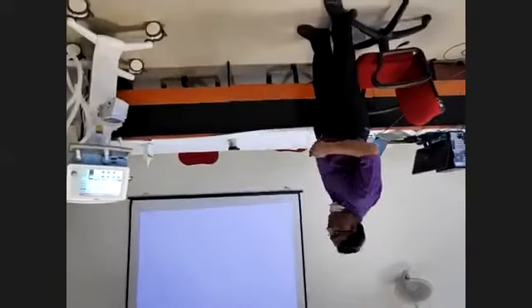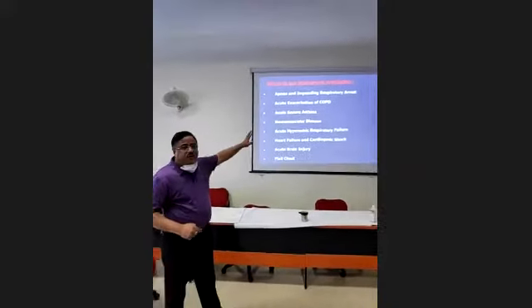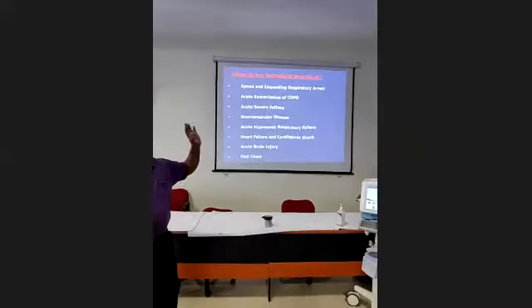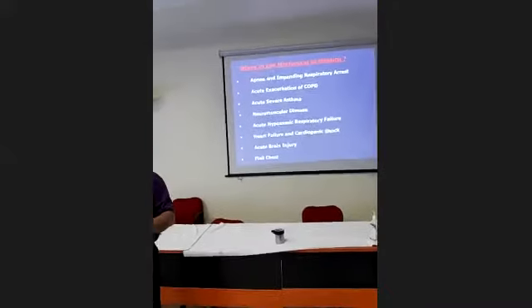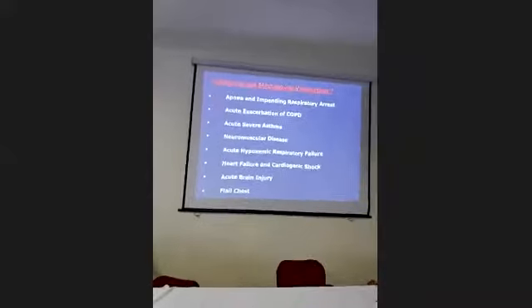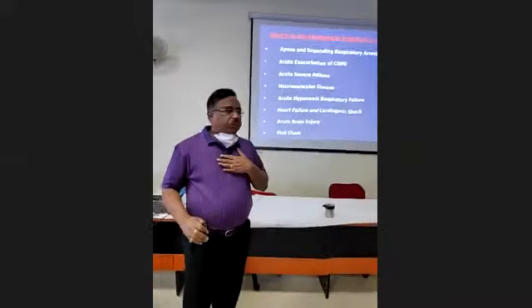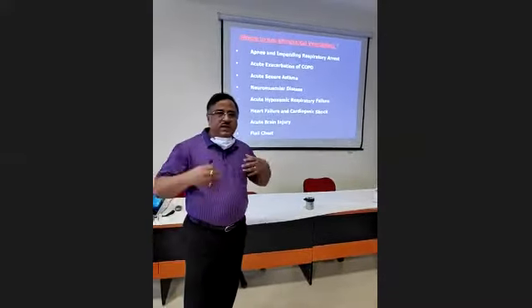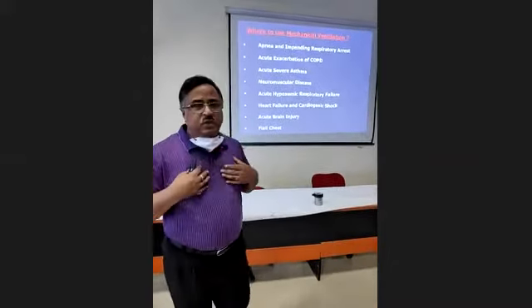Then the next question which comes is where to use this mechanical ventilation. If you look at our textbook, there are a number of indications written in the book, but for the sake of understanding at the bedside, when you are there with the patient, you can understand it in a different way. A ventilator takes care of the respiratory system. So first of all, we have to think about the problems which arise because of the respiratory system.